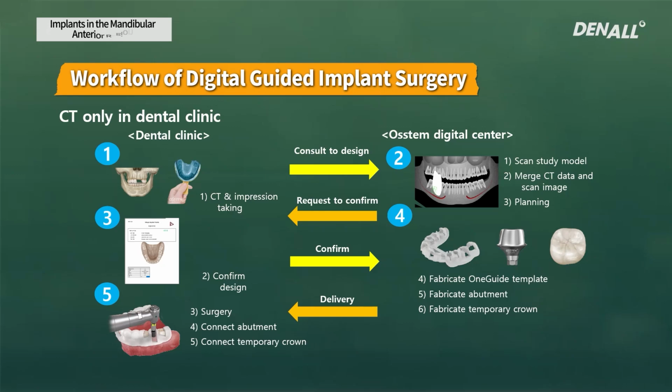For guided surgery, for immediate treatment, you need to prepare things in advance. In your clinic, if you do not have all the devices, it may take time, so you cannot do it all at once. However, it can give you very good outcome of treatment, and you need to compare different options and check clinical characteristics.